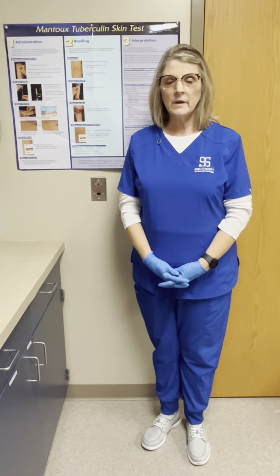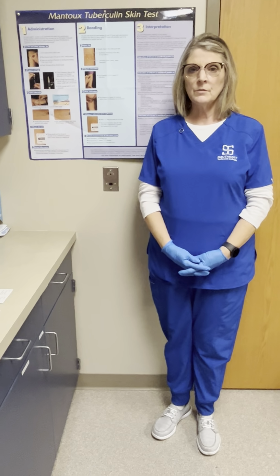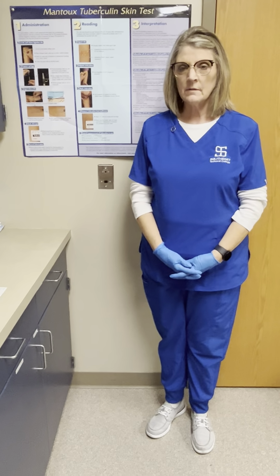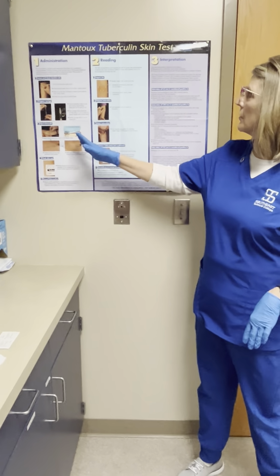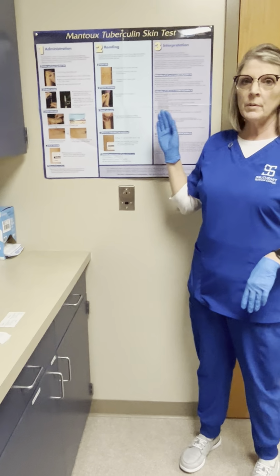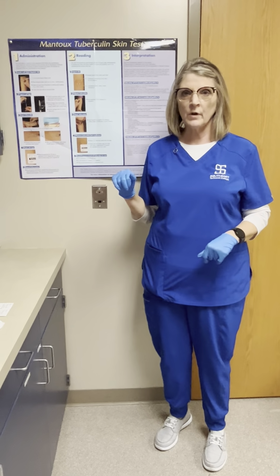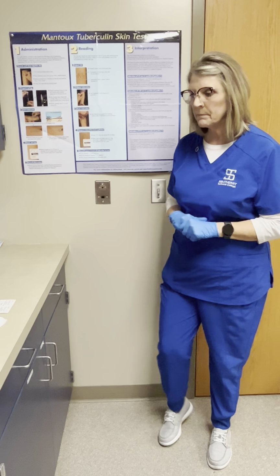Hi, my name is Julie, and for my demonstration today, I'm going to show you how to administer a TB test. This is a good visual aid to show you the three-step process: administration, reading, and interpretation. But for the purposes of this demonstration today, we're just going to focus on the administration piece of the TB testing.